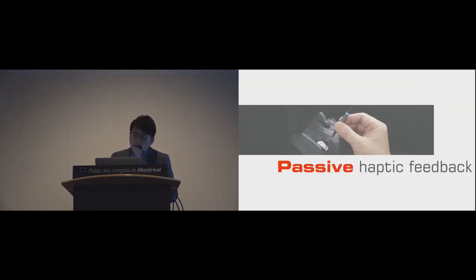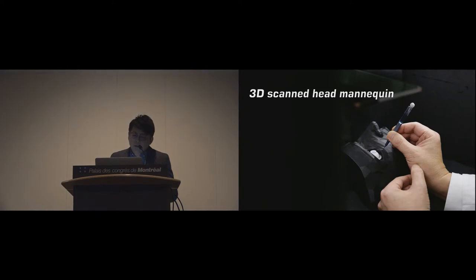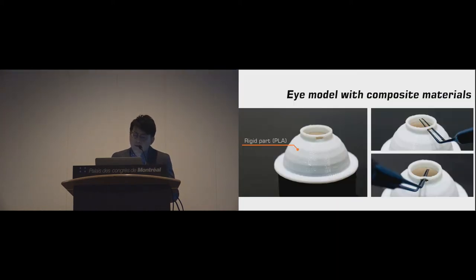We use two realistic models to provide passive haptic feedback. For a novice surgeon, finding a stable hand posture on a patient's face is the first challenge. A 3D-scanned head mannequin with realistic bone structure can help them to practice. The eyeball is soft during cataract surgery. We 3D-printed the upper part of the eye model with soft material to simulate this property. Therefore, the instrument can be rotated in a vertical direction, and the forceps opening angle will be limited while tilting.